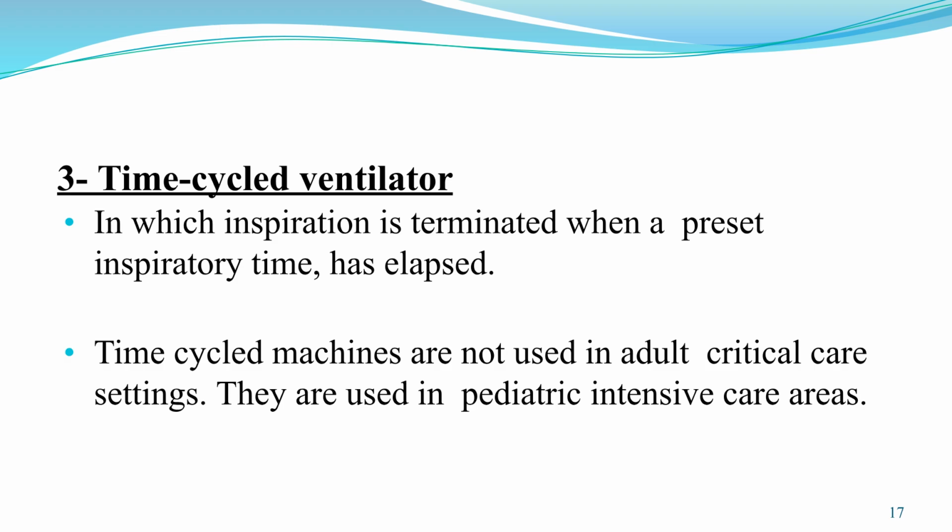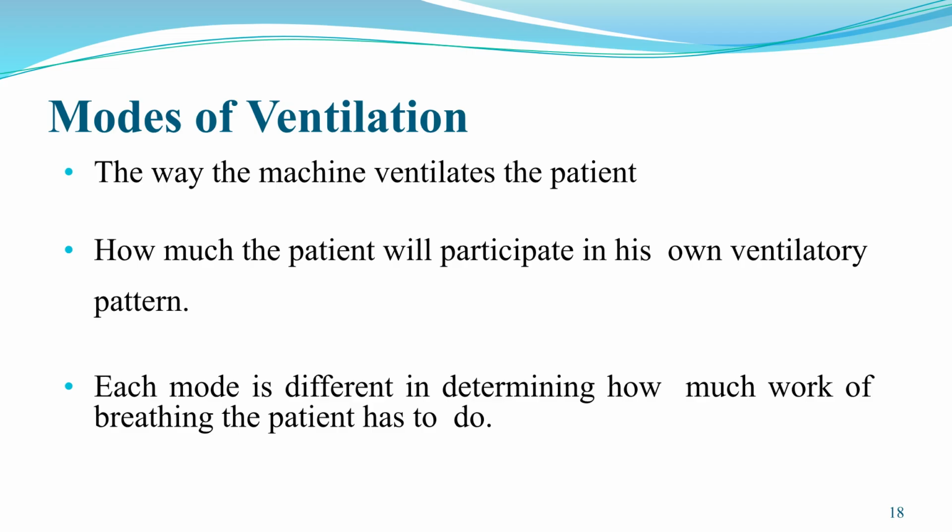A time cycled ventilator ends inspiration after a preset inspiratory time has elapsed. These are mainly used in pediatric intensive care areas, not adult critical care settings. Modes of ventilation describe how the machine ventilates the patient and how much the patient participates in their own breathing. Each mode determines the amount of work of breathing the patient has to do.